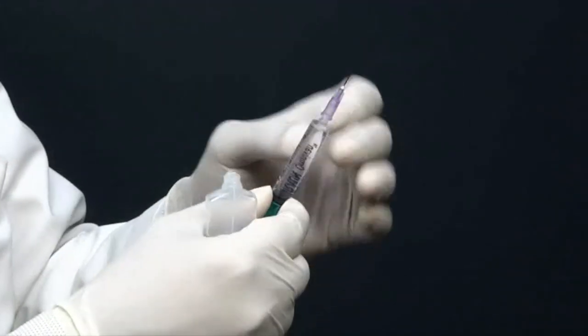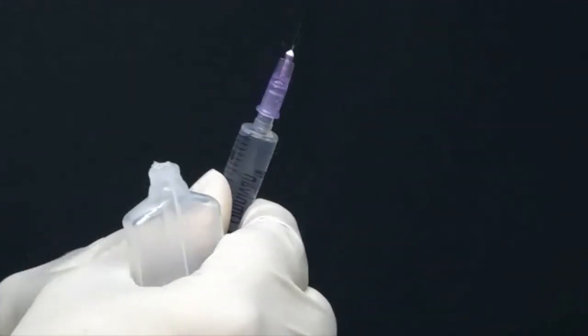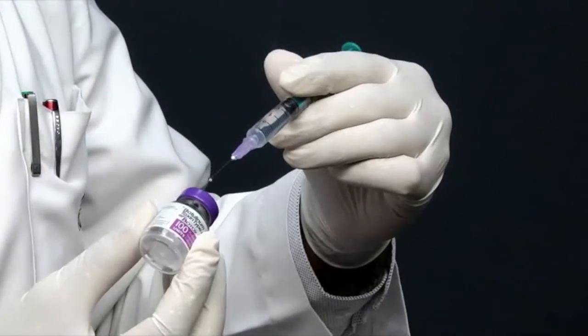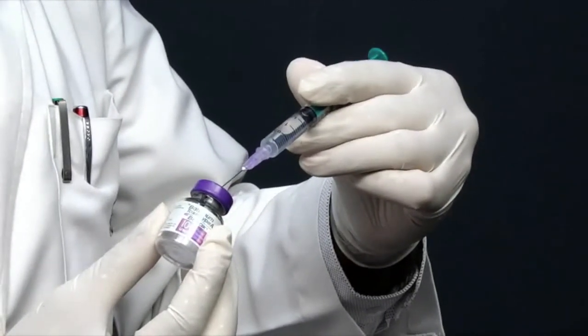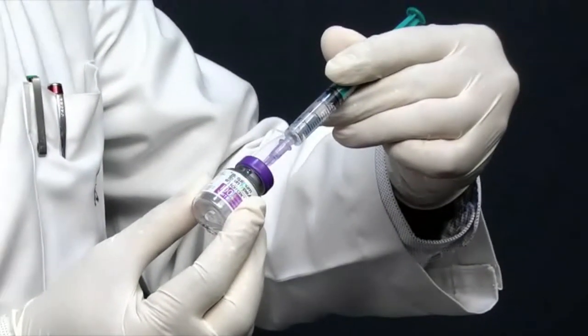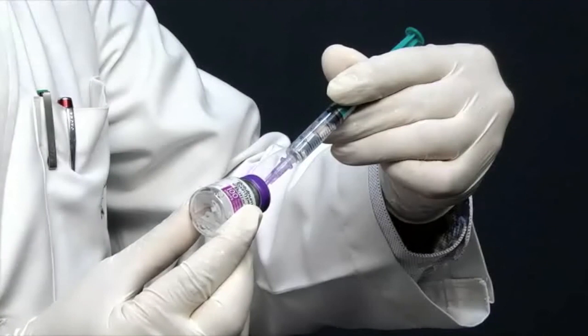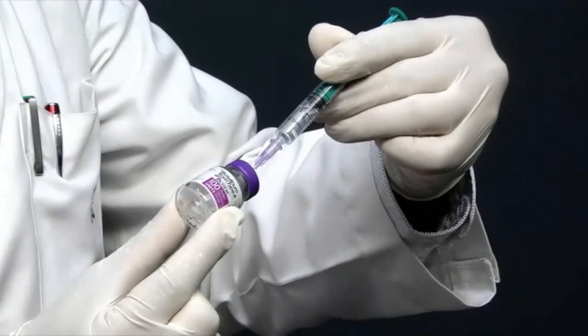Here we are ready with 2 ml of the drug — make sure all the bubbles are taken out. We have 2 cc's of preservative-free normal saline pre-drawn in a syringe and the recently opened Botox vial. You can see that there is a kind of suction within the vial that will pull the saline in. Keep a track on the piston so that the drug goes in very slowly, drop by drop, along the side of the vial as we reconstitute.